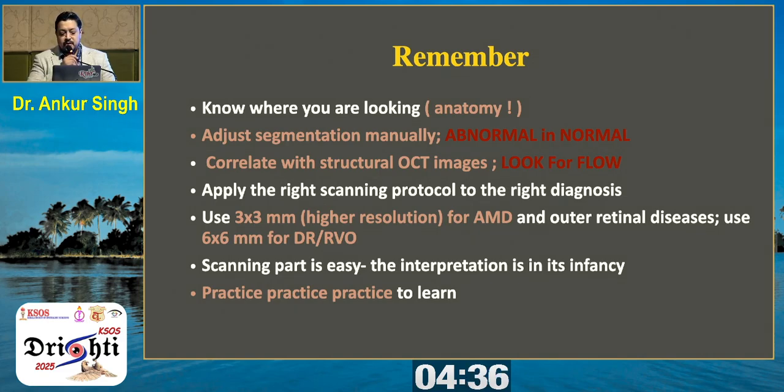Always remember that you should know the anatomy, because unless you know it, you cannot identify it. Second, always adjust the segmentation manually. Look for the abnormal in the normal. Correlate the structural OCT with the en-face OCT. Look for the flow as well. Apply the right scanning protocol to clinch the diagnosis.